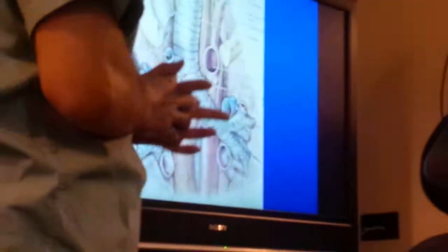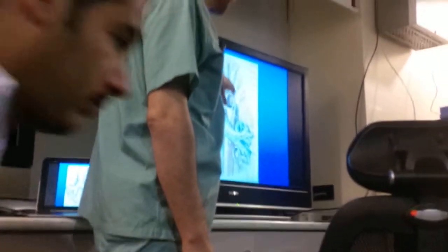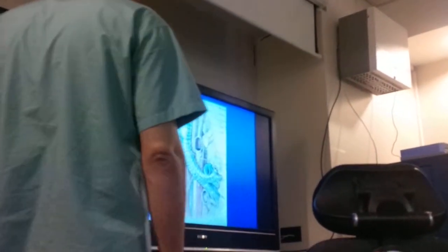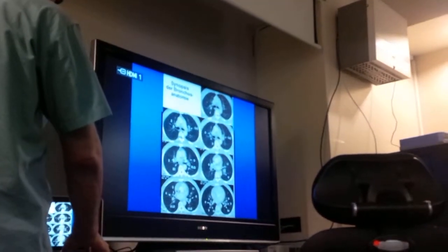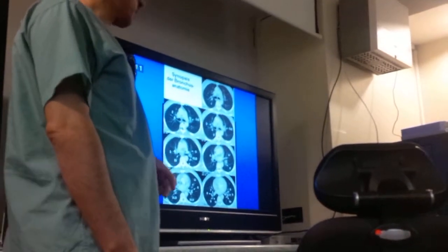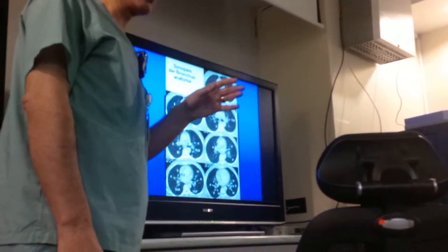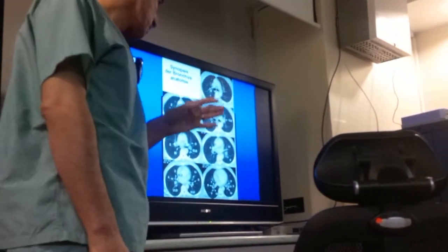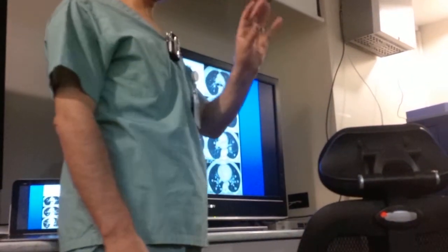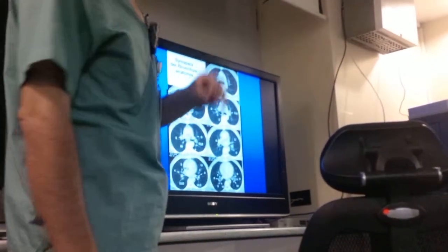Now we have to know the adjacent structures to the trachea. We have the aortic arch, we have the esophagus posteriorly, and we have the azygos vein. Usually, whenever you have patients for thoracic surgery or lung resection, you have a CT scan. So we look at the CT scan, we never look at the report. The report is not important for us because the report will not focus on the airway and the distribution of the airway. They focus only on the pathology in the lung or anywhere, but they never give you hints on the upper airway.